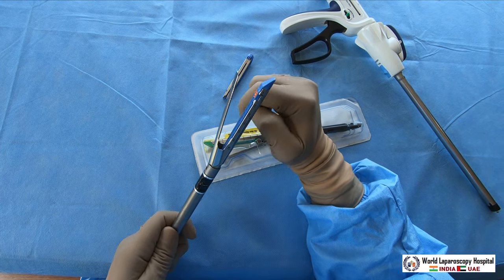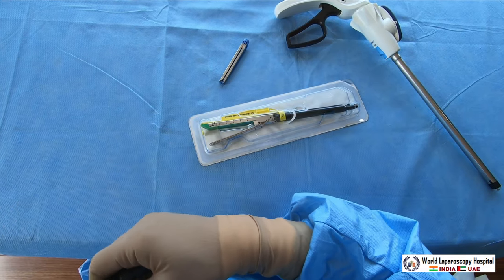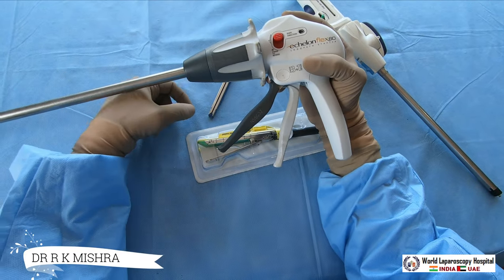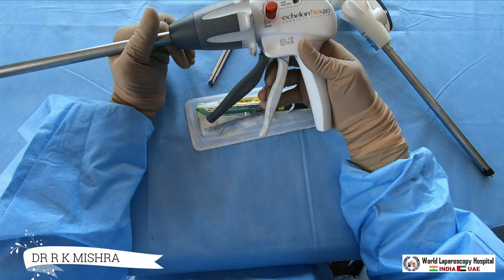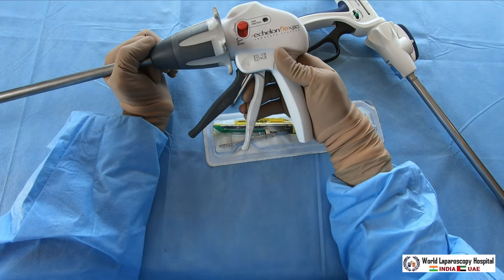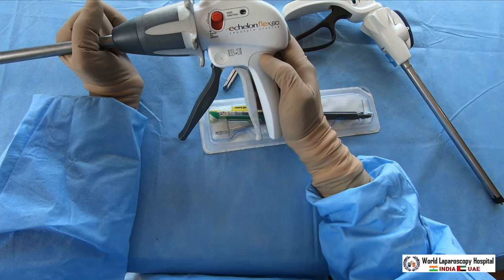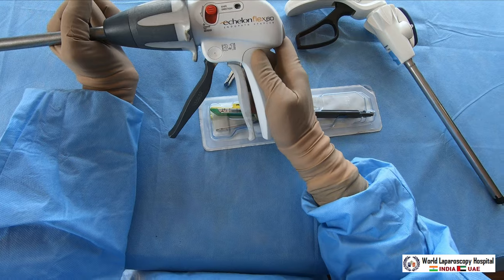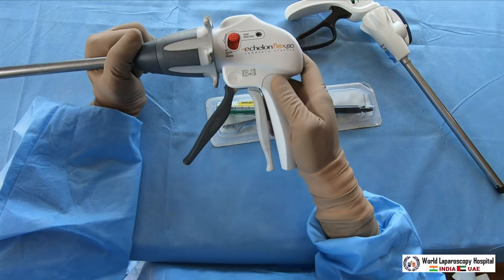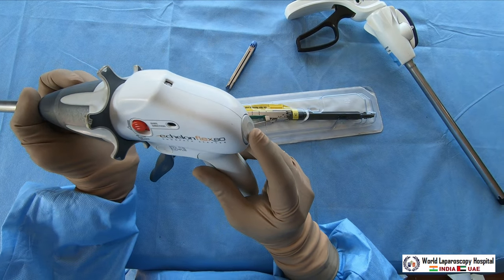When using it, you need to be careful about the handle. There are two handles - one is white and another is gray. The white handle is just for holding. You can hold the bowel with the white handle and it will not harm or fire. If you feel it is not held properly, you can open it using this knob.